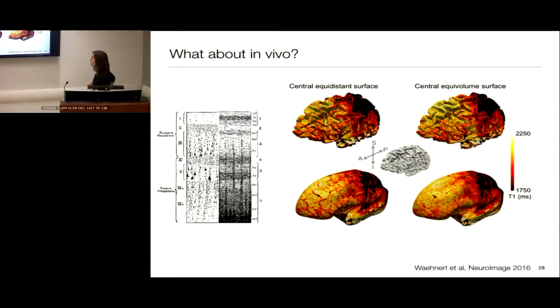So actually, this was really of interest to the people who are doing cortical mapping and structural analysis, but it was also a huge win for the functional MRI community, because there are a lot of people trying to do high-resolution functional MRI at 7T, and what they wanted to do was differentiate the cortical layers because they wanted to show the difference between the input and the output layers. So this was a huge win for them as well.